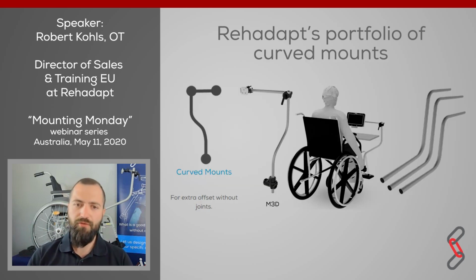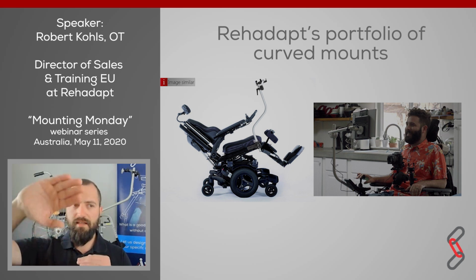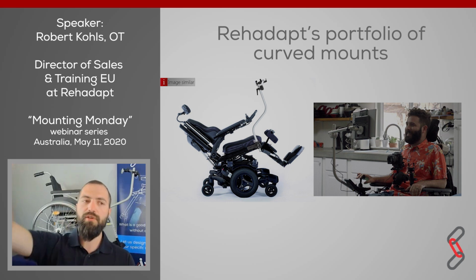But as soon as there is a lap tray attached to the wheelchair, sometimes the 2 tubes or the 3 tubes come to a very early limit. So that's the reason why we also have these S tubes or curved tube solutions that can also be attached on the power chair, also on that side where, for example, the control unit of the power chair is. As you can see here in that example, we are using an attaching point and a frame clamp point on the side of the wheelchair, and now we are using these S-shaped tubes to come from the seating plate upstairs, going forward and onto a good high position.